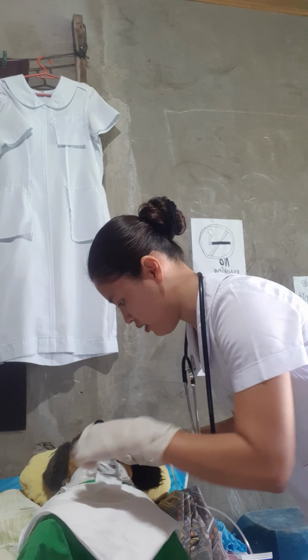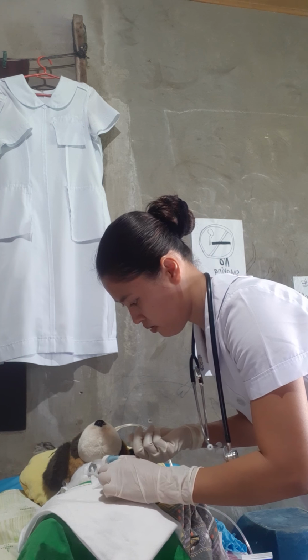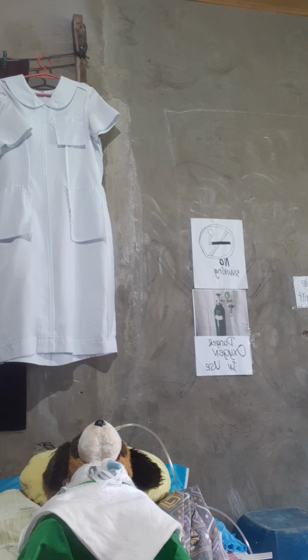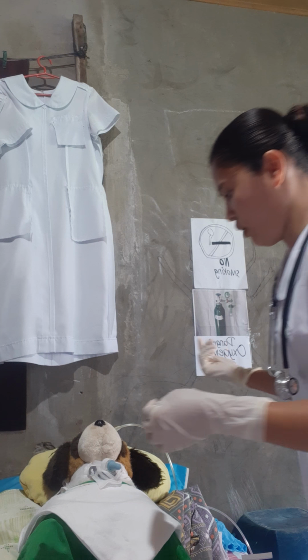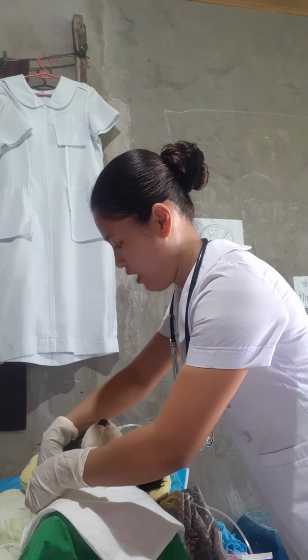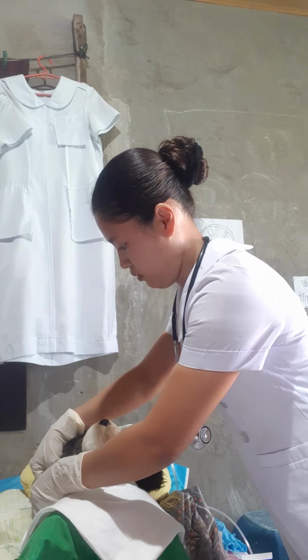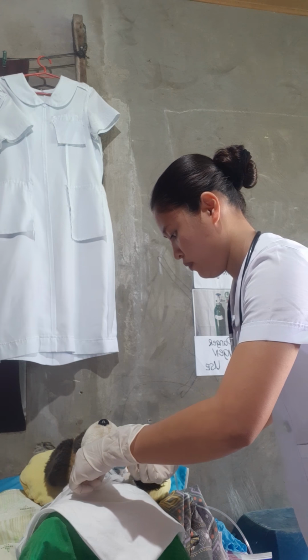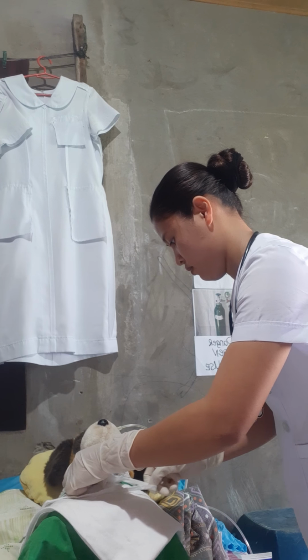We just need to slit it, and then after changing the dressing we need to do the tape and ties. We're going to remove this one gently.